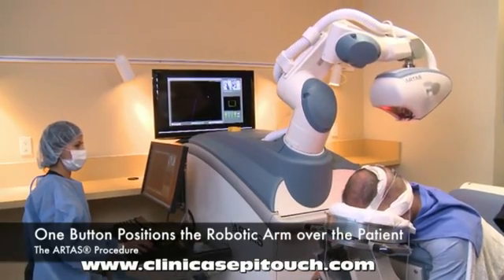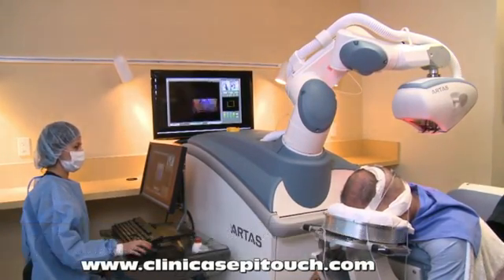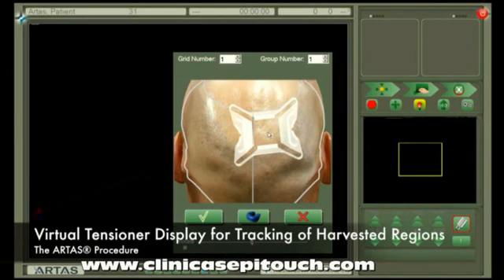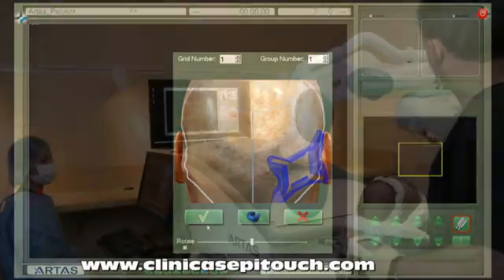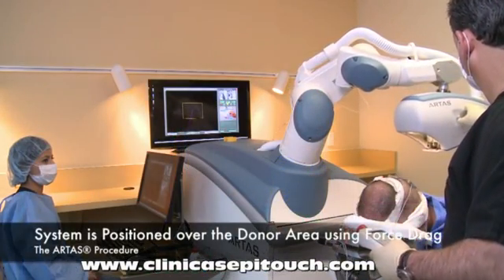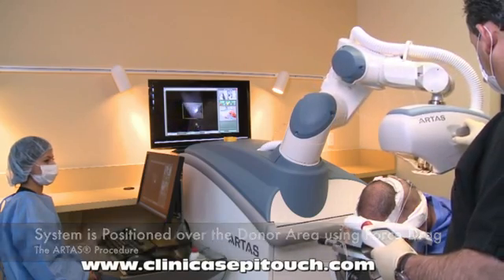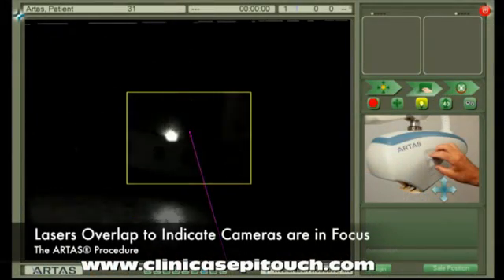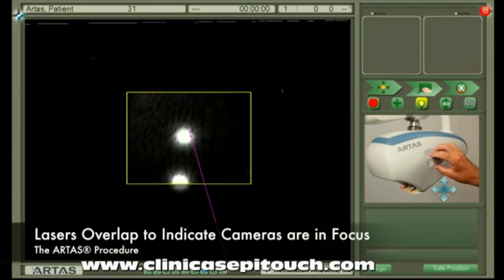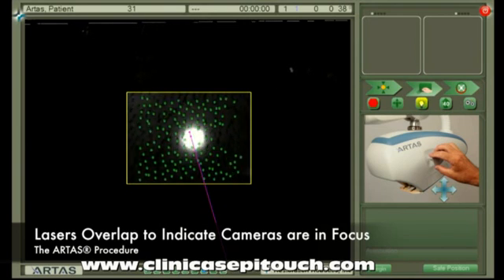With the touch of a button, the operator positions the robotic arm over the back of the patient. The computer side operator will now position the virtual skin tensioner on the virtual head, allowing them to quickly track areas that have already been harvested as well as plan ahead for the next area. By holding down a button on the ARTAS pendant, the patient side operator drags the system into position. Two lasers help the patient side operator locate the system — when the dots overlap, the system is in focus and no longer needs to be moved.